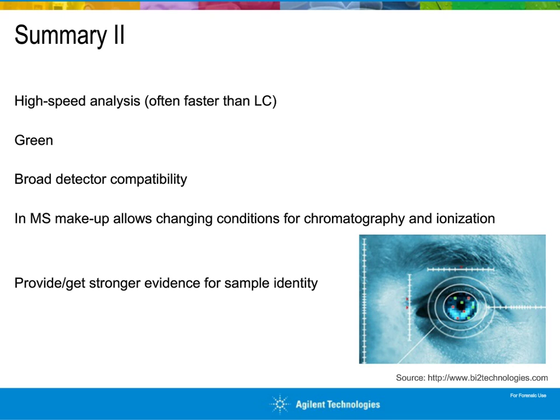Then MS make-up gas flow could be modified to increase the sensitivity, which is some sort of a next step we are planning to do. And you get even a stronger evidence for the sample identity using an orthogonal technique for the analysis.